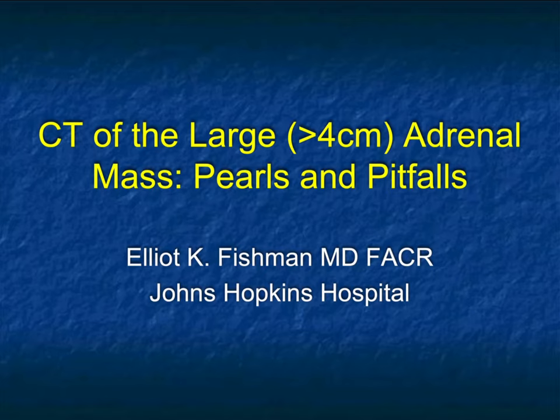So what I'm going to do in this talk, and it's going to be a multi-part talk, is go through some of the challenges we have, cover some of the various lesions, how I think about the lesions, how I can feel comfortable making the diagnosis, and what happens if I have a differential diagnosis. When do we do biopsy? When do we do follow-up? When do we do surgery? So it's really going to be a very, very practical approach, but we're going to look at a lot of cases. I have a lot of examples, and we're going to look at a wide range of pathologies.